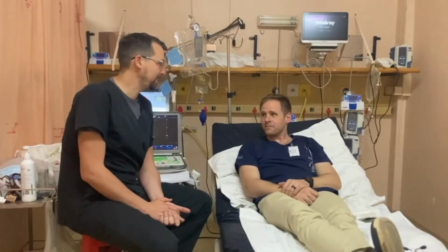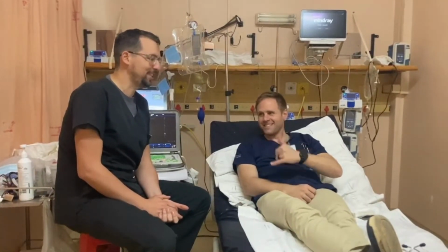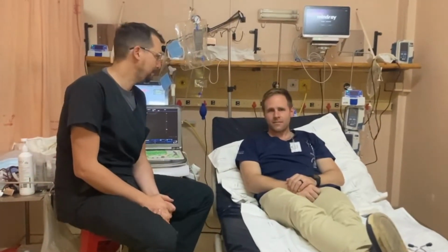Today we're going to be doing gastric ultrasound. Don has very kindly volunteered to not eat this morning so that we can do it with an empty stomach, a stomach full of fluid, which we'll show you second, and then a stomach full of pasta.